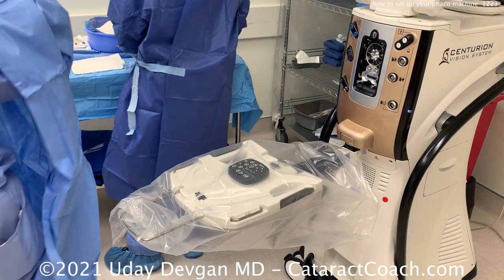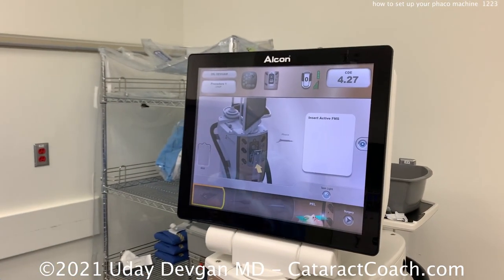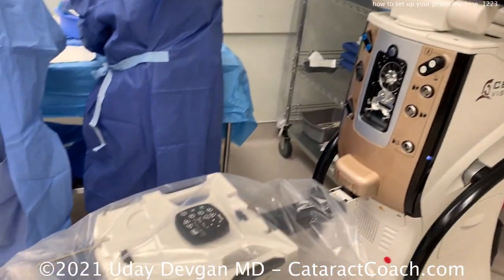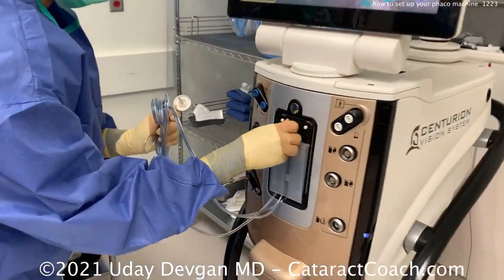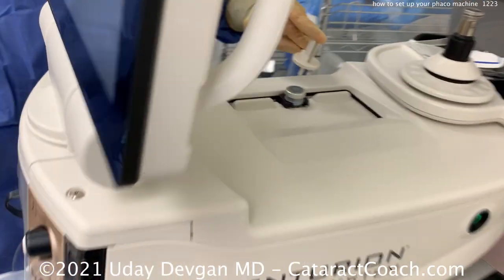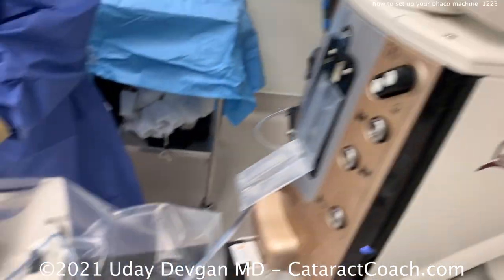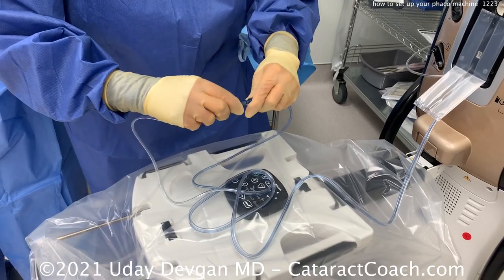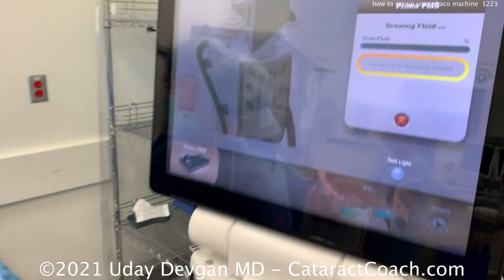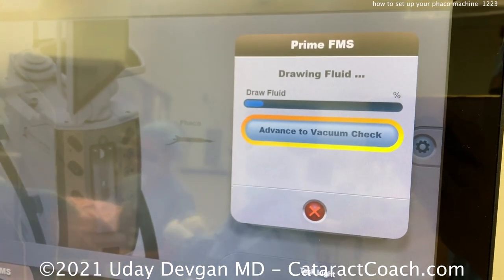Now we've got to get the cartridge and install it, then plug in through the infusion line. The machine is very simple — it gives you direct instructions on the screen telling you how to do it. Place that cartridge in there sterilely; don't contaminate your hands. Then we can place that connection to the inflow fluid. These two here are connected together, with instructions right on the machine. Using the remote control, you can advance to the next step — it says it's drawing in fluid, getting fluid through the line, making sure there's no air in the lines.